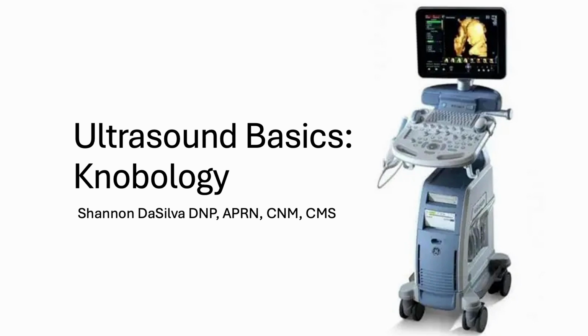And so I am going to go over the basics of knobology to help you understand what you can do to enhance and get a better image, and also to understand when you have the sonographer that you're working with adjusting things possibly for you or with you, to know what is happening and what is making things clearer and better for you to diagnose and manage the patient situation.